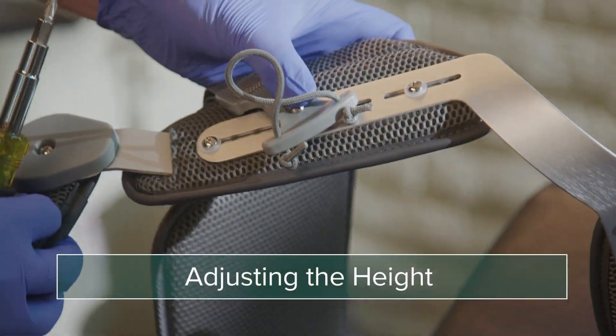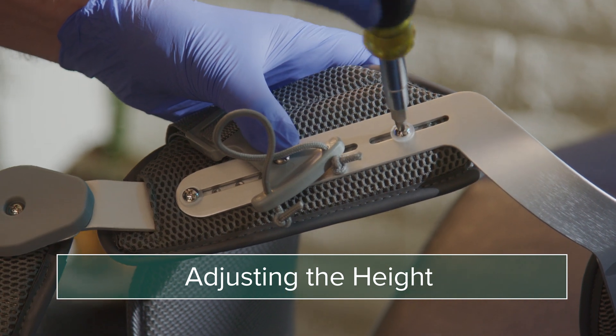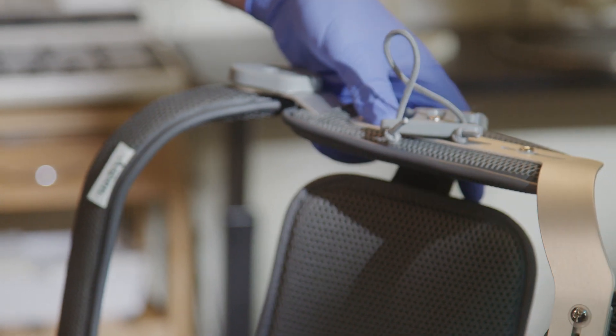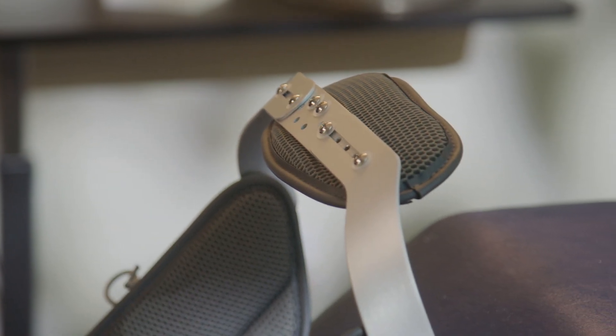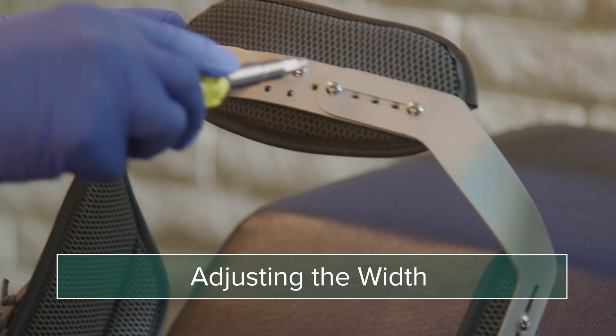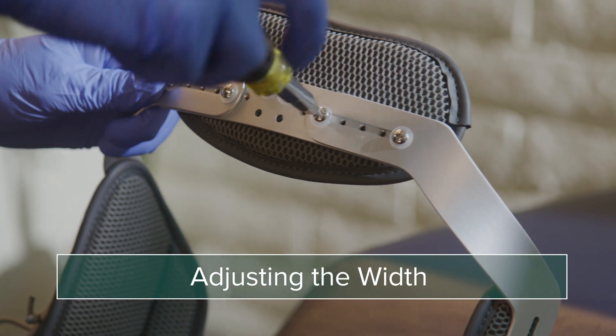To adjust the height, a clinician can remove the screws on both sides of the brace. Note that the screws on the lever latch will also need to be loosened or removed. To adjust the width of the brace, the screws at the top of the brace can be removed and the brace adjusted appropriately by a clinician.